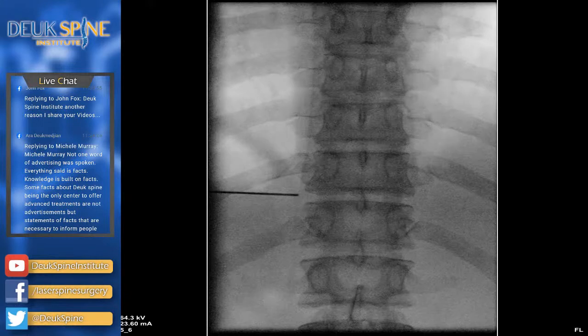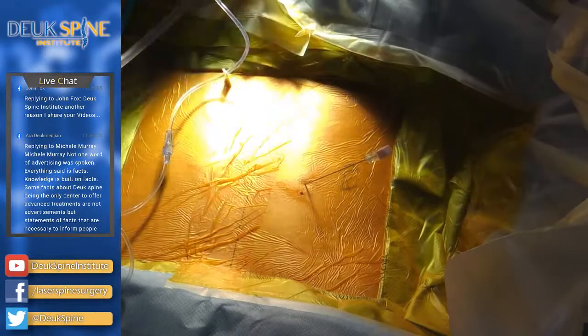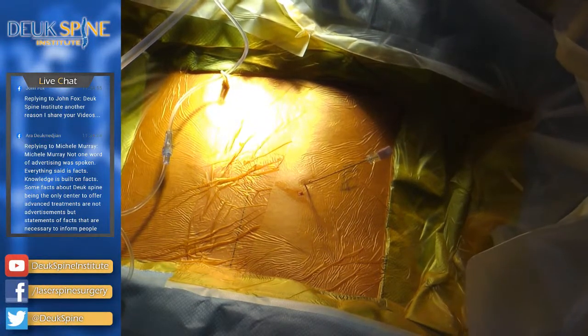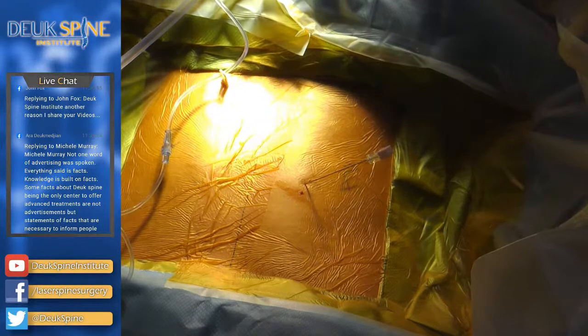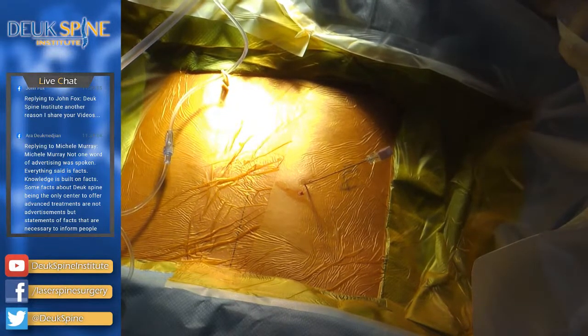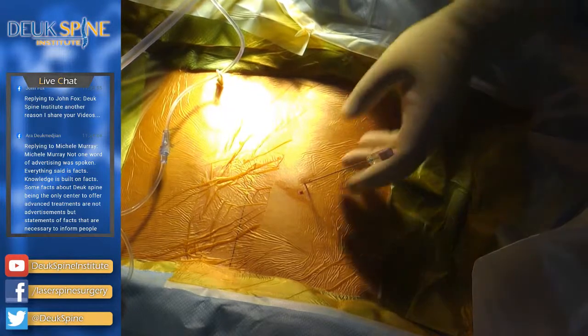Lateral. So how do we know where T12 is? Well, you can see the rib come in from the side. It's a dark thing, and it attaches to the pedicle. Really, the transverse process and pedicle of T12. So we know that bottom bone is 12. We know the one above has to be 11. The further down vertebrae doesn't have a rib. It's just got a transverse process. So we know that that one there is, that looks pretty good.